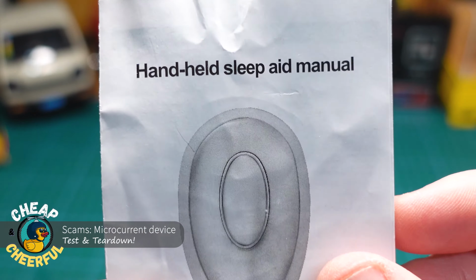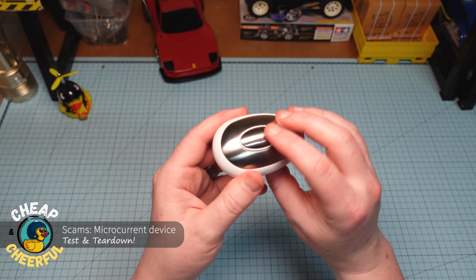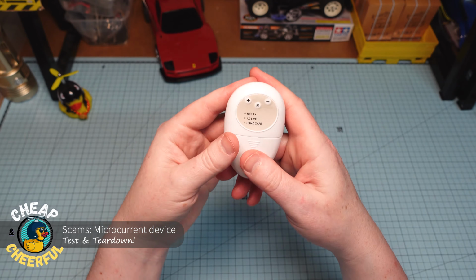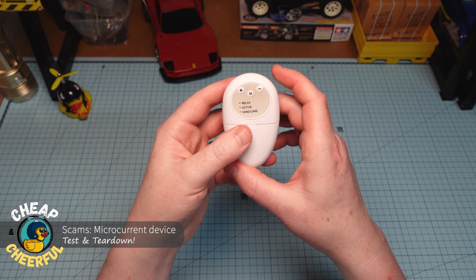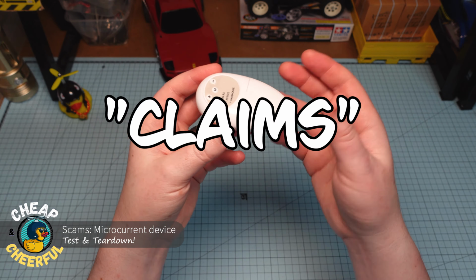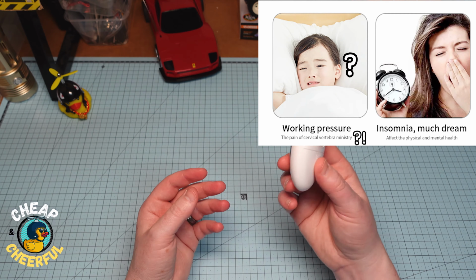So yeah, it does all kinds of things. Looking at the instruction manual, it does everything from help you sleep to improves your concentration, helps you learn, helps you be more happy at work. I just had to have it and see what it was that they would offer in order to satisfy those kind of claims. Bullshit. And yeah, it certainly gives you bang for your buck.